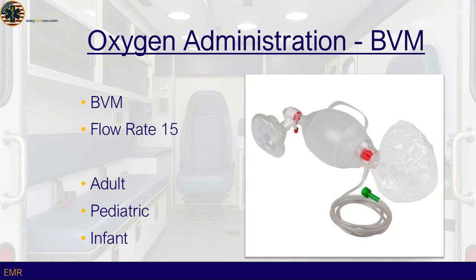However, in an ideal setting, 2 rescuers should be used, one to hold a mask and maintain an open airway while the other squeezes the bag. Additionally, inserting an oropharyngeal, OPA, or nasopharyngeal airway, NPA, can help keep the airway open, especially in unconscious patients. Rescuers must be cautious of overventilation, as providing too many breaths or squeezing the bag too forcefully can cause increased intrathoracic pressure, reducing blood return to the heart and worsening patient outcomes.